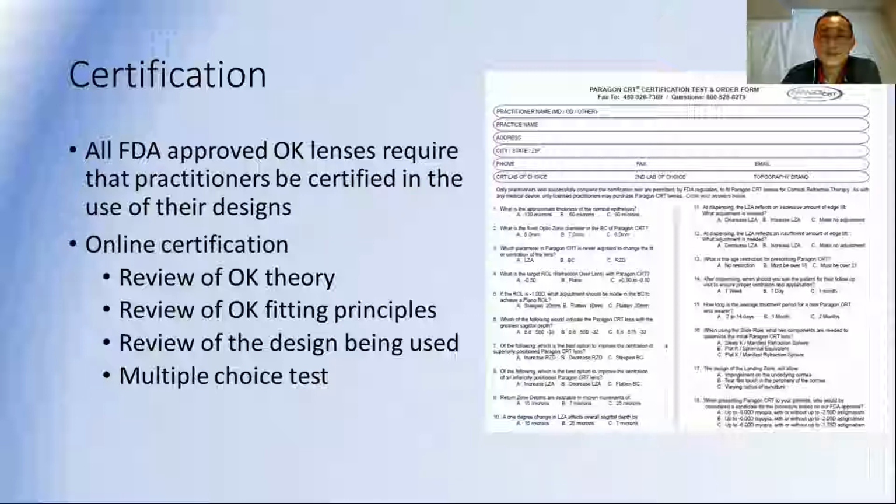All of this, in terms of safety and the proper fitting of Ortho-K, I think is critical to make sure that we are taking the best care of our patients that we can. And in the U.S., at least, and I think in all countries now, the companies that make and design and sell Ortho-K lenses require certification to make sure that the practitioners know how to fit the lenses and know what the risks are and how to manage those risks in their patients.